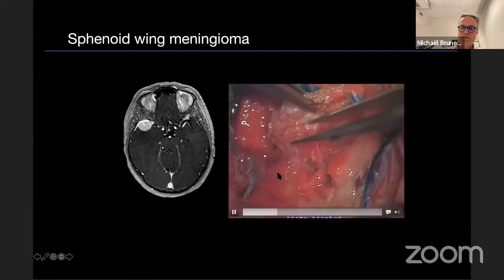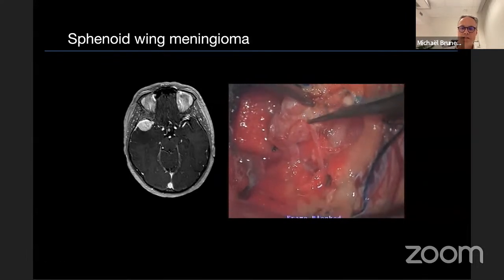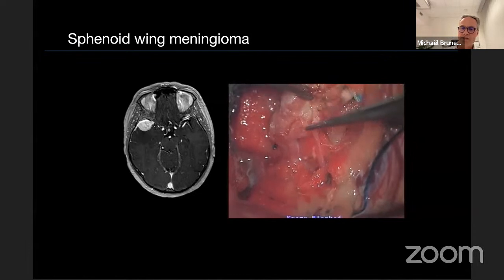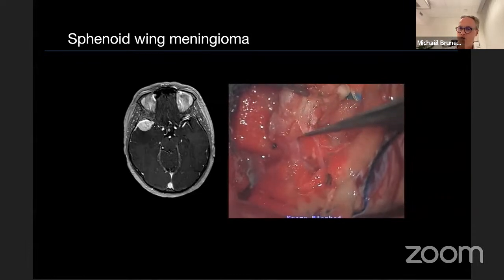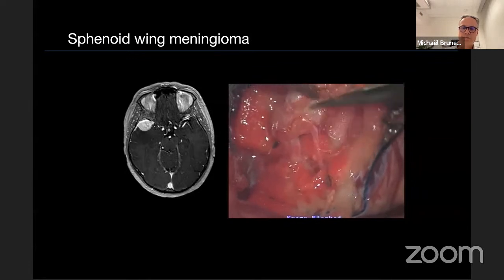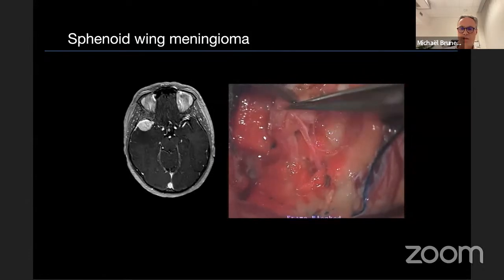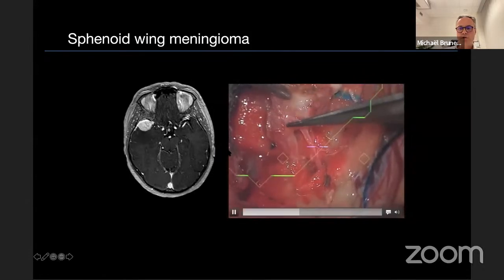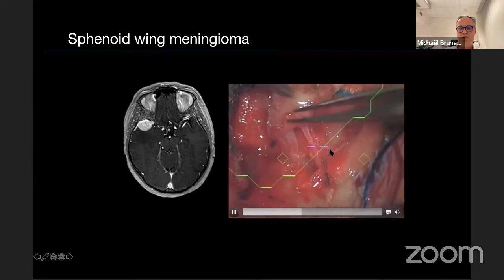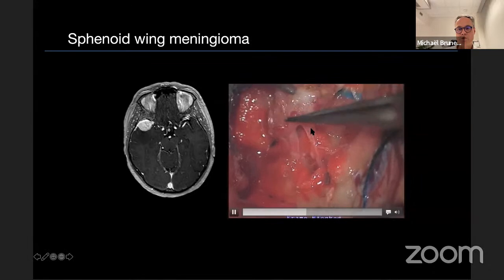You will see the diameter of the vessel is quite high at this level. The dissection is quite hard. You will see that the vessel comes very easily up to the point where a small pseudoaneurysm will happen. And you will see a very small tumor, but in the end, not so easy to handle. You see here the development of a small pseudoaneurysm.